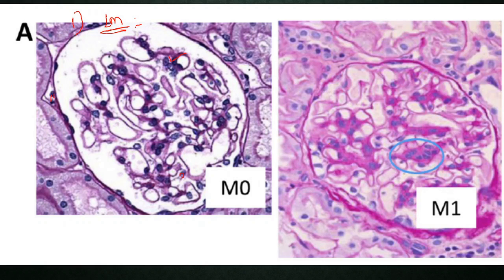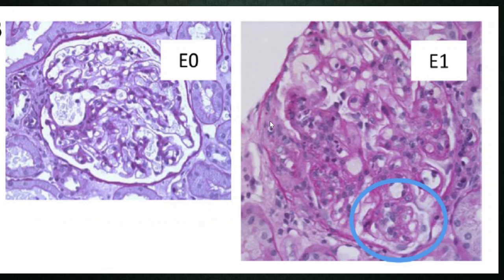Looking at the MEST-C score images: here is M0 because there is no mesangial hypercellularity; M1 shows mesangial matrix expansion along with cellular expansion. Next, endocapillary hypercellularity — you can see inflammatory cells inside the capillary lumen, giving a score of E1 versus E0.